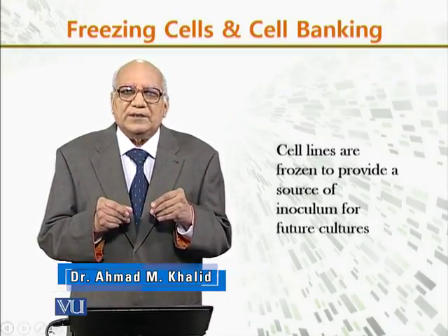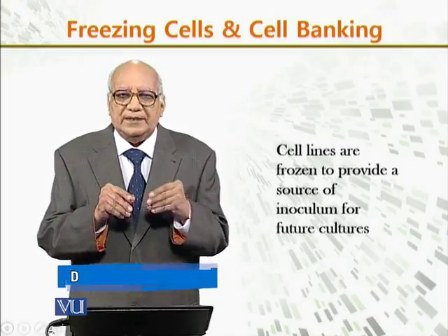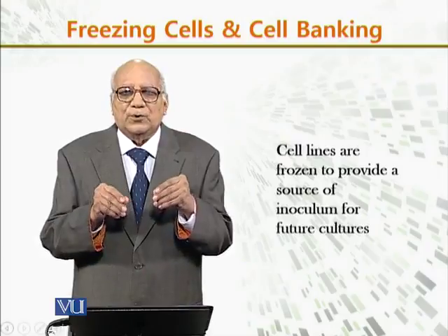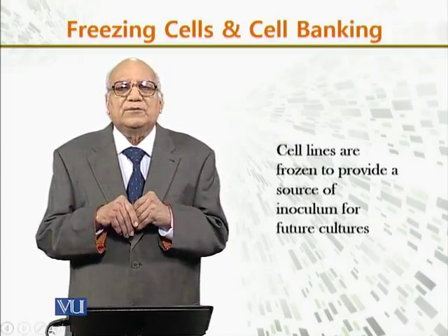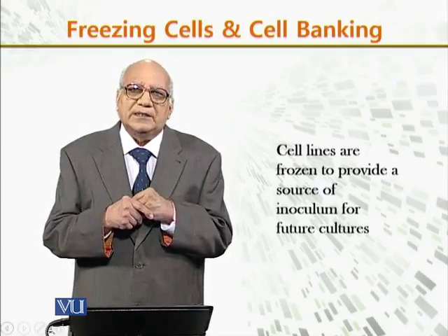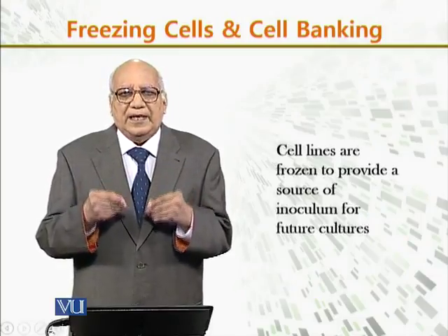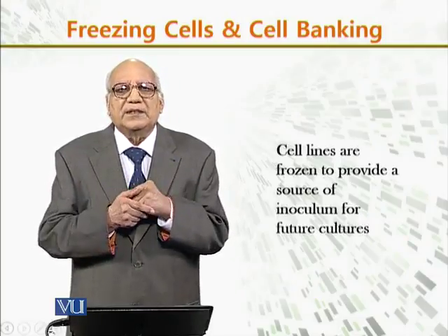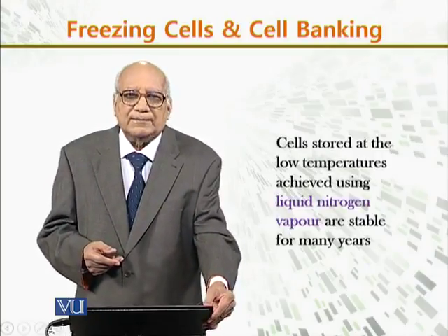To achieve this, the cell lines are taken and frozen to provide a source of inoculum for future culture. That is, for our future experimentation, those cells are taken, frozen, and used time and again whenever desired.